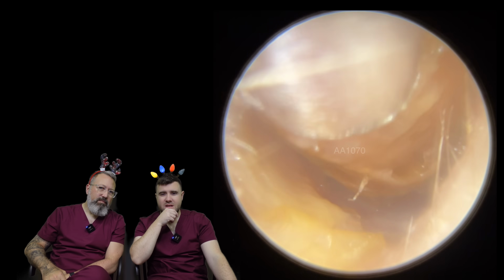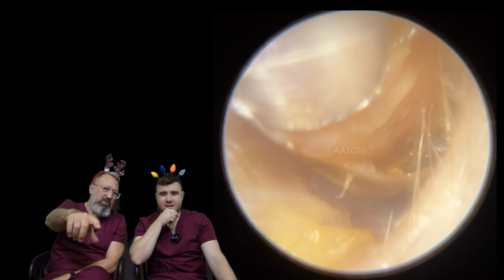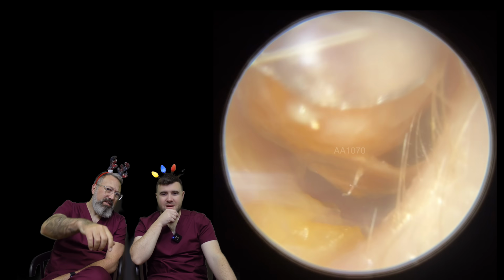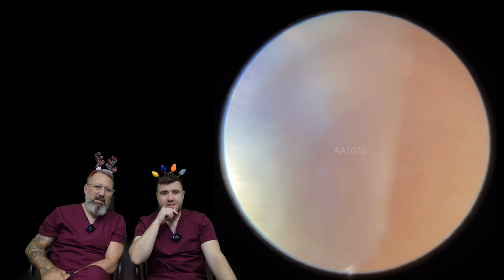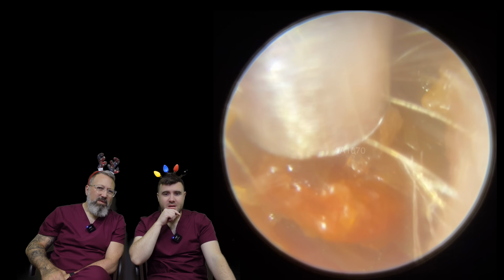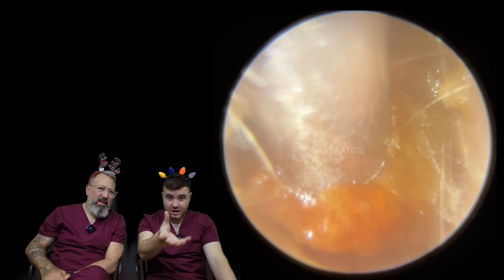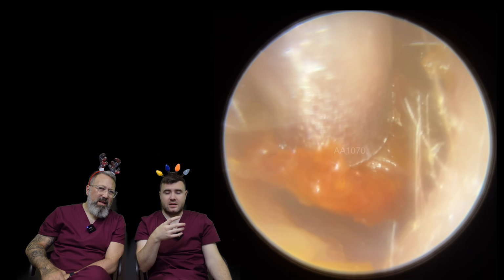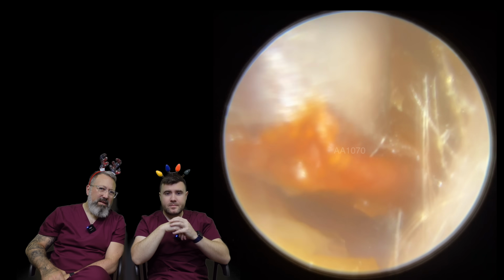Oh, there we go. Look at it starting to peel. It's just holding on the left-hand side, is it? Yeah, that's right, I'm wiggling it loads here. You can see it just pop out then. Lovely. And we've got another section. Usually they shouldn't be as bad when you start taking out all that skin and wax that was attached to start with.